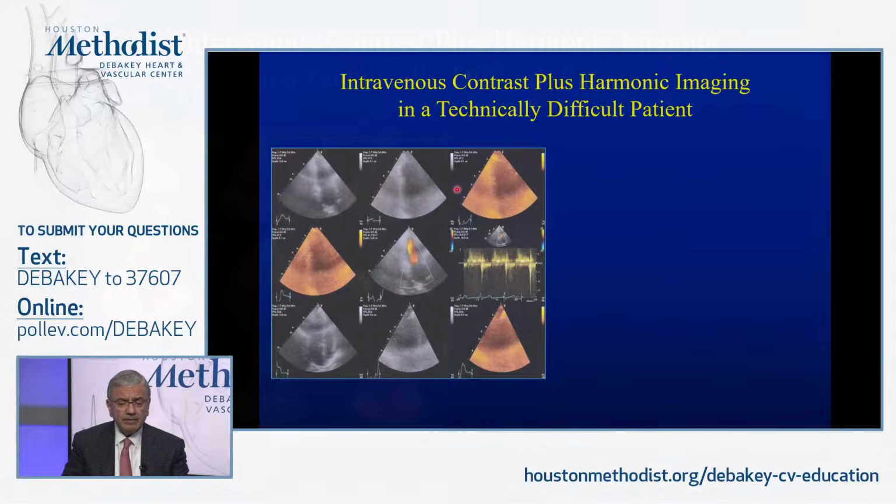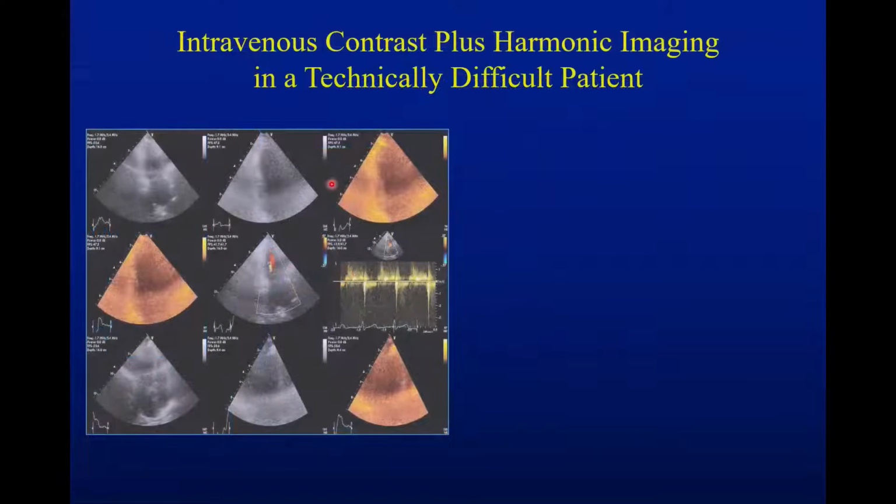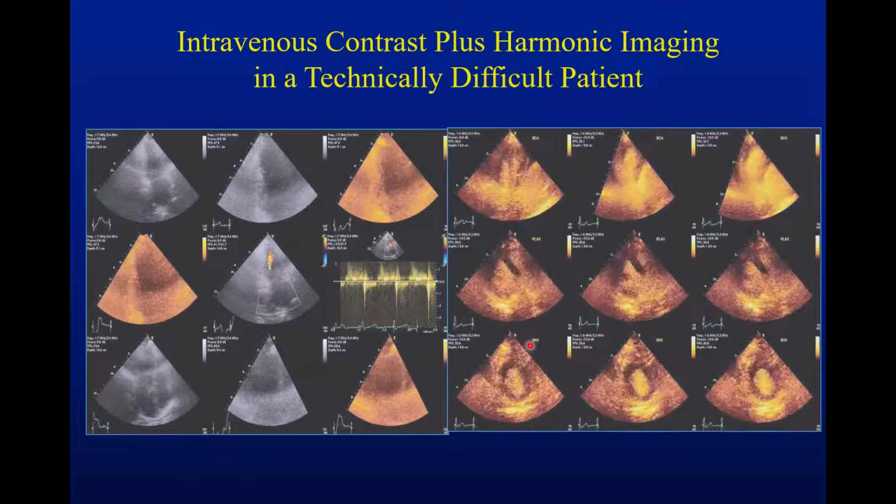Now, if we use contrast, I think the major application, and that's what's FDA approved for contrast echocardiography, and we will have sessions on each one of these methodologies, is to enhance image quality. It is very hard to understand where the heart stands, and what the function of this heart is, in its fundamental look at the frequencies here.